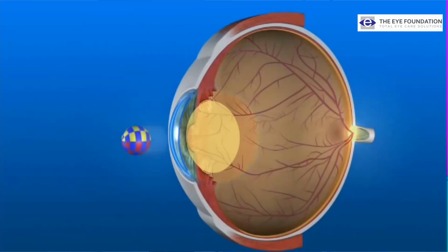So today in this video I am going to talk about the types of intraocular lens which are available for modern cataract surgery. Before getting into the topic, let us understand what a cataract is. Cataract is nothing but the natural crystalline lens which is present inside the eye becoming opacified or forming a clouding due to advanced aging. It interferes with normal daily routine activities.